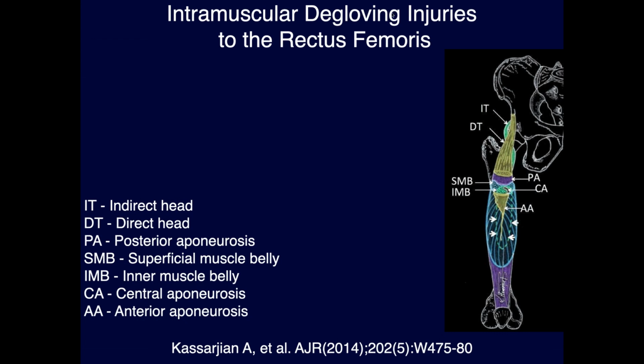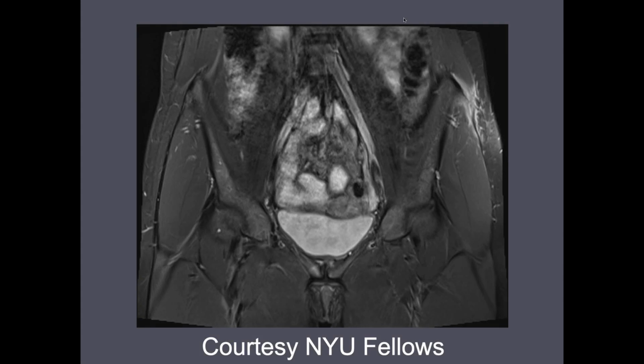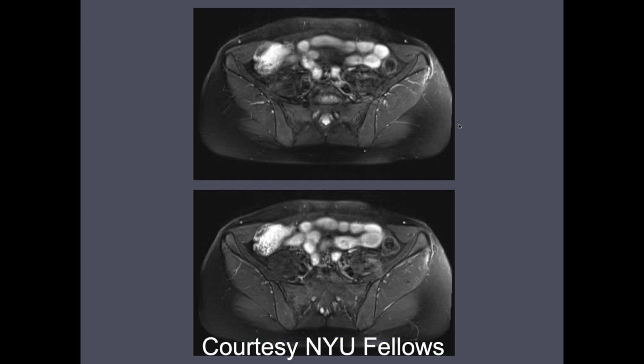And you can also get more distal injuries to the rectus femoris muscle as well. Here you can see where you can have tears within the muscle itself. They can be adjacent to the musculotendinous junction, which extends for a long distance in the rectus femoris, or just out in the muscle itself. And here are some other injuries around the rectus femoris origin where the tendon now is intact. This is primarily a musculotendinous junction injury.